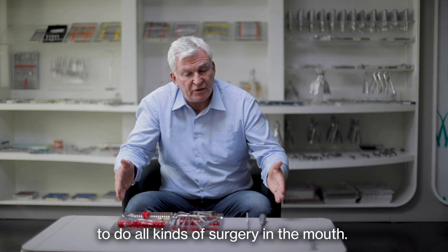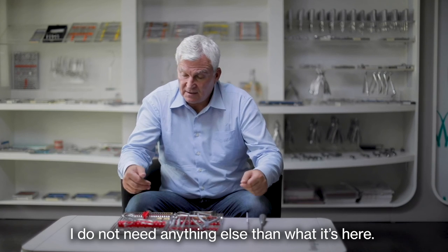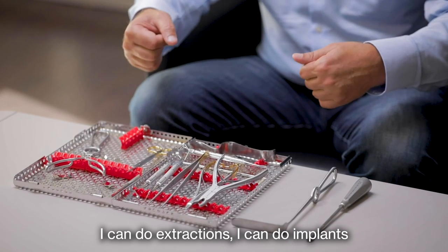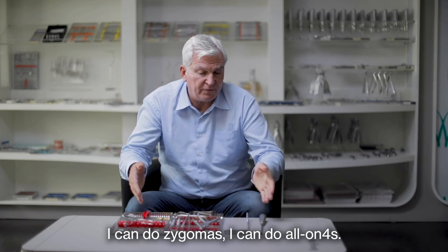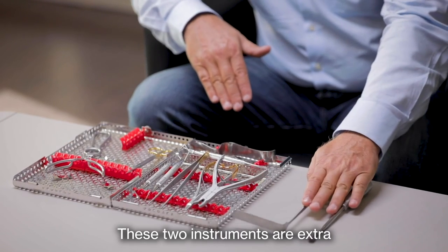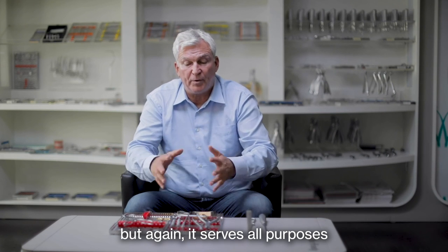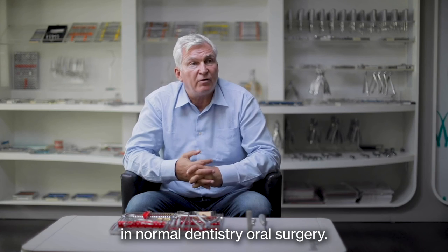Basically, these are all the instruments I use to do all kinds of surgery in the mouth. I don't need anything else than what is here. With this kit I can do sinus lifts, extractions, implants, zygomas, and all-on-fours. These two instruments are extra for the zygoma technique, and this one is for the all-on-four, but again it serves all purposes in normal dentistry and oral surgery.